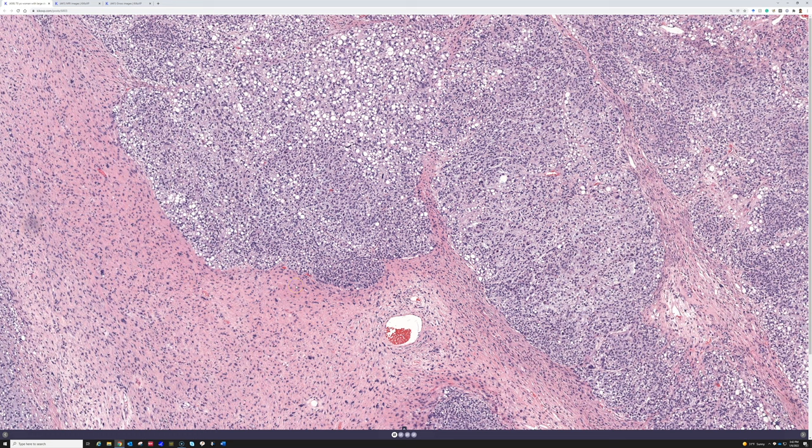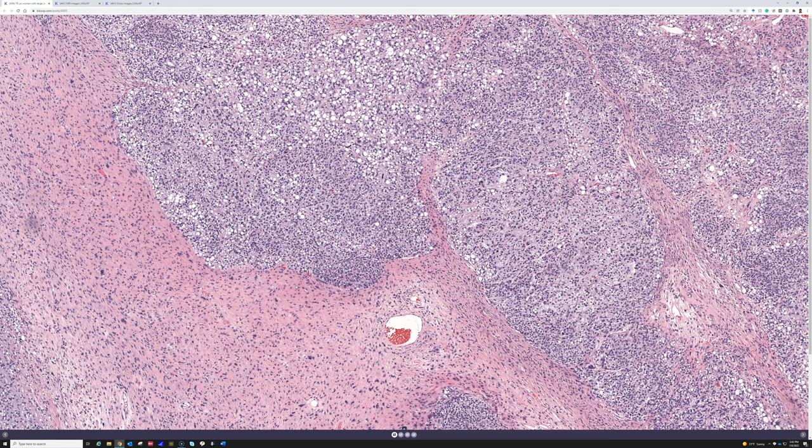This is a pleomorphic liposarcoma. By definition, these are high-grade sarcomas that have pleomorphic lipoblasts. They can have a wide range of patterns — just like dedifferentiated liposarcoma has a wide range of patterns, pleomorphic liposarcoma does too.